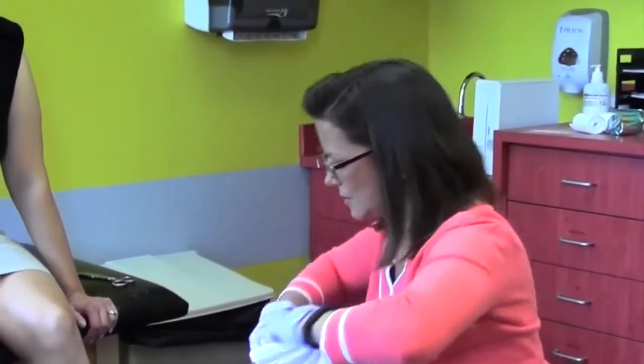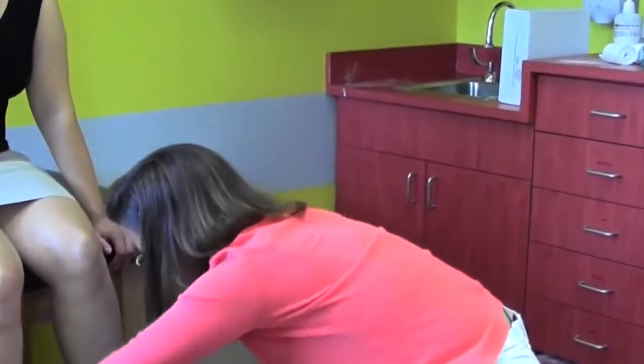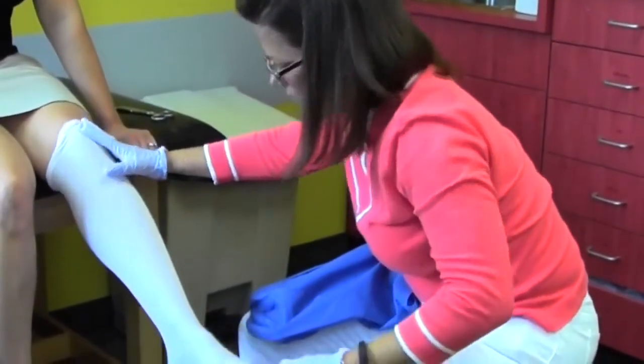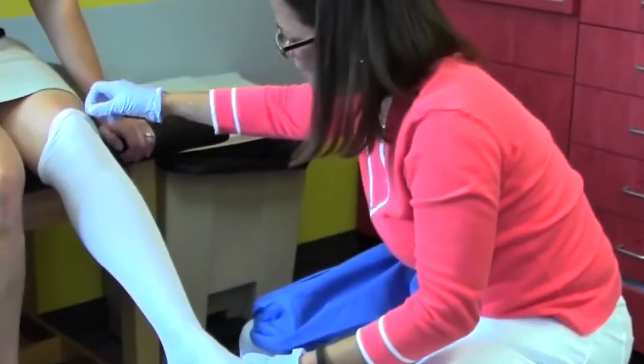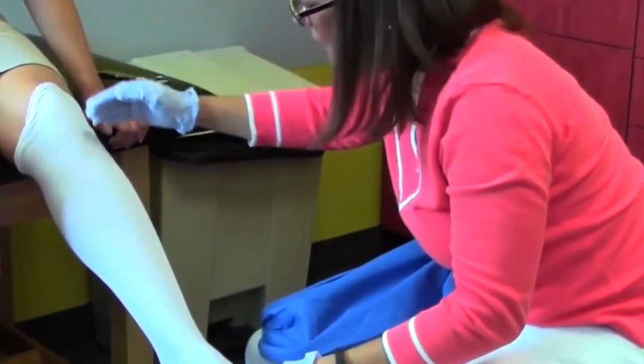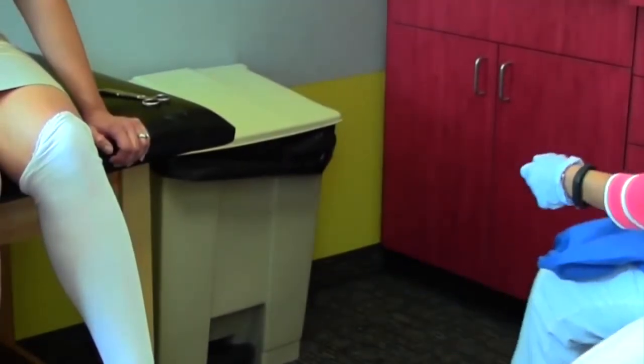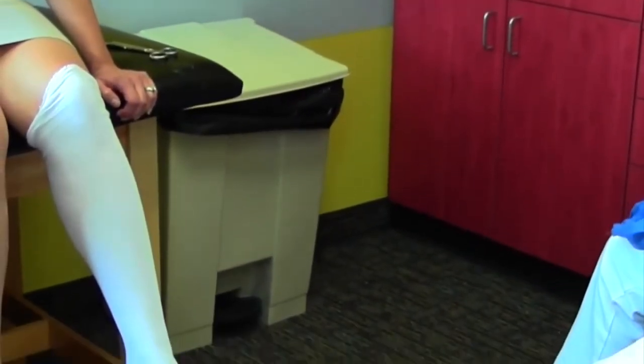Our base layer in a short leg cast is stockinette. You can use cotton stockinette, polyester stockinette. It's your preference as far as that goes. Stockinette can always be cut excessively long. You can always cut extra off. If you make it too short, you can't add to it. So we always tell people, make it as long as you think you're going to need or longer.